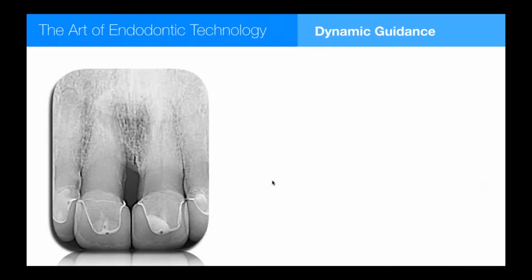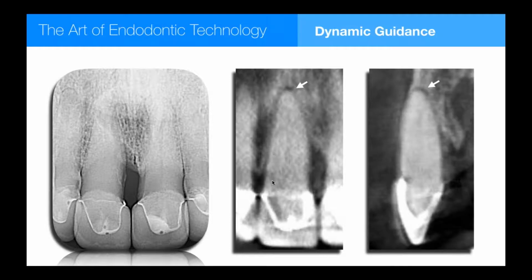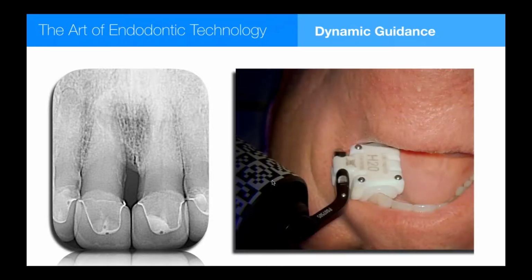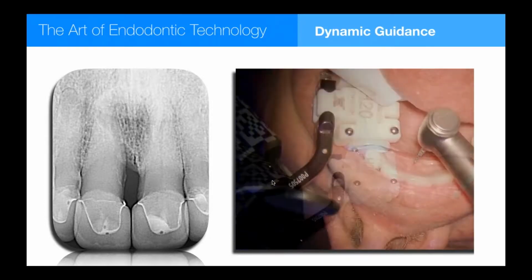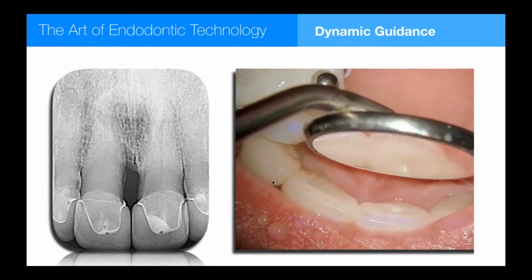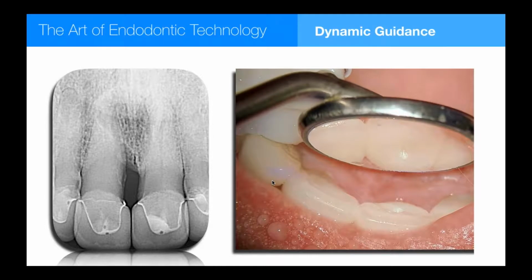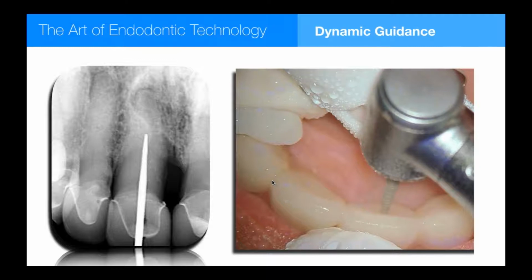This is a central incisor, again, a lesion that doesn't show on conventional films. We see apically, it's there, and obviously we knew that because the patient's tooth is sensitive to percussion. There is no canal in the coronal 2/3 of the root. This is the fiduciary clip in place. That was me positioning the drill tip on a target so the machine knows exactly where it is. We find out the position of entry, and here's the first check film. Here's the second one, and this canal was intersected about 3/4 of the way up.